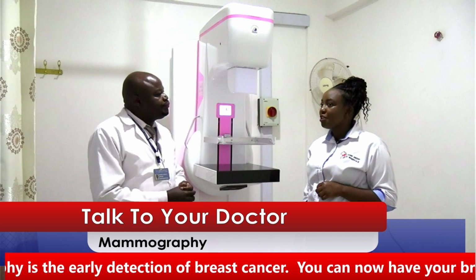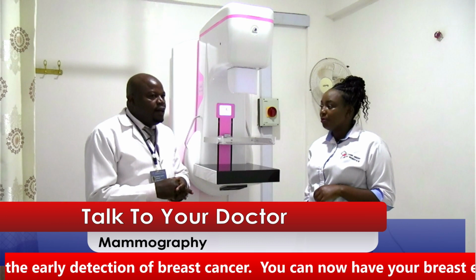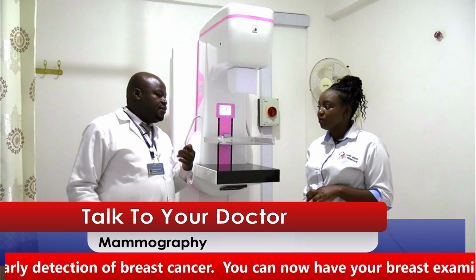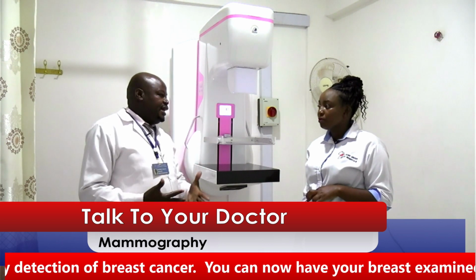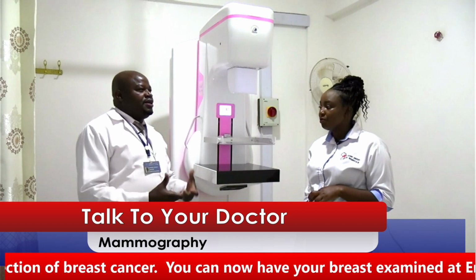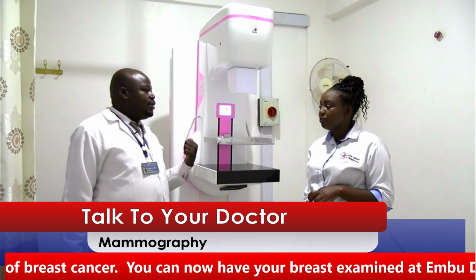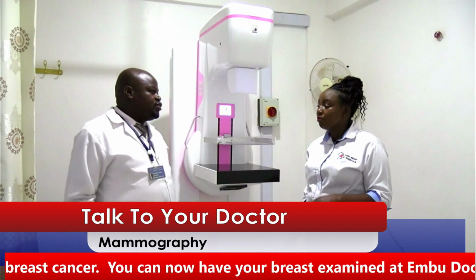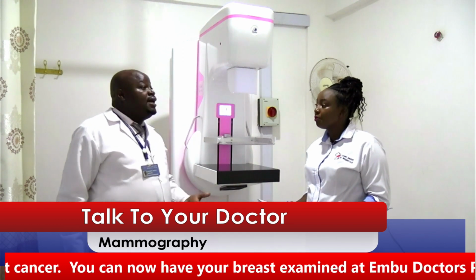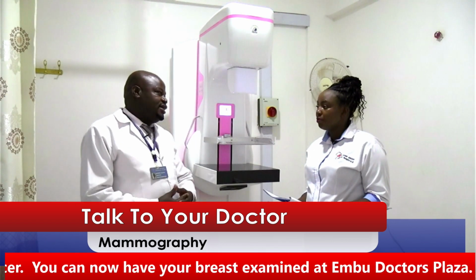What is the difference between having a breast ultrasound and having a mammogram? There are those tumors that, when you do the mammogram, cannot be defined by the mammogram. So whenever the patient presents with a lump that cannot be accurately diagnosed by the mammogram, then you send the patient for the ultrasound. Ultrasound is able to diagnose such a problem. And again, ultrasound does not have ionizing radiation, but the mammogram has ionizing radiation.